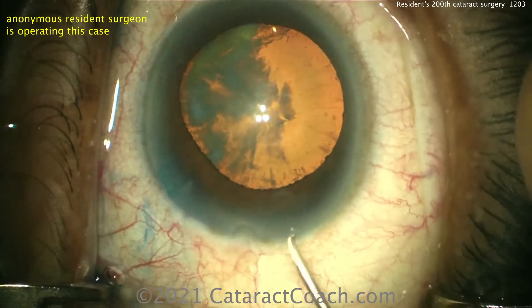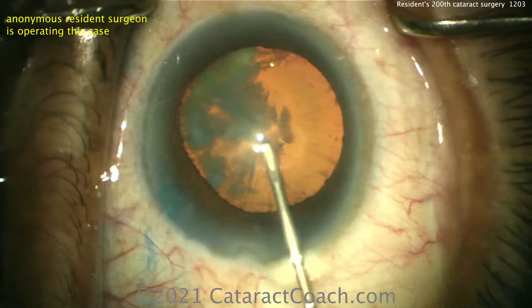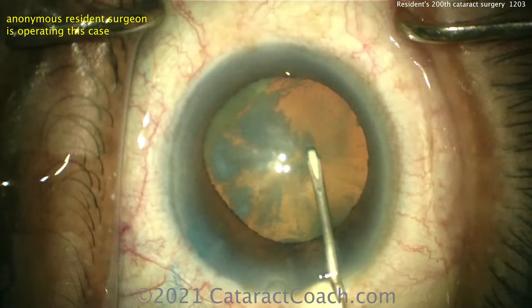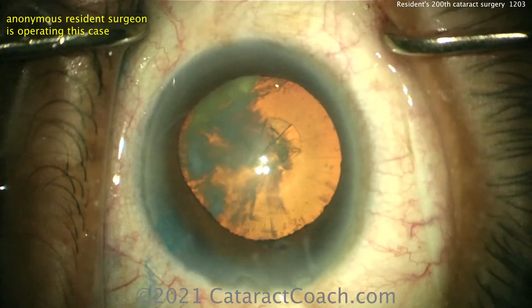Let's see what we've got next — cystotome to start the rhexis. Centering up the scope, that's good. Poking in the middle and getting that flap turned over — that looks pretty good — then doing this in a counterclockwise manner.